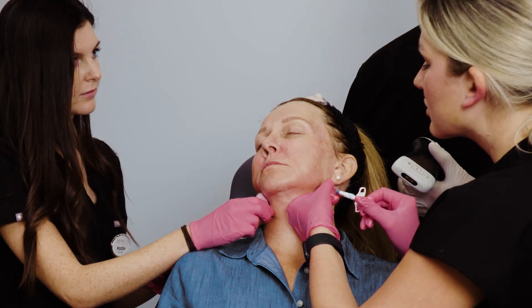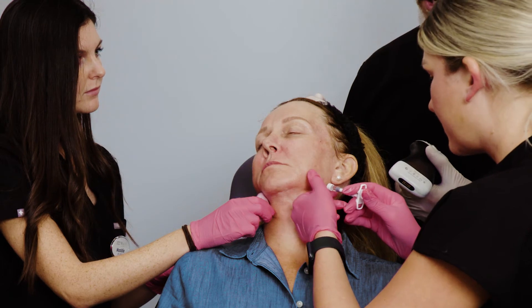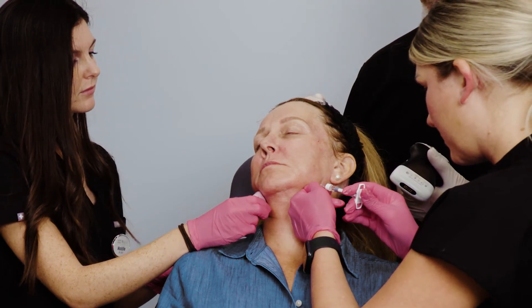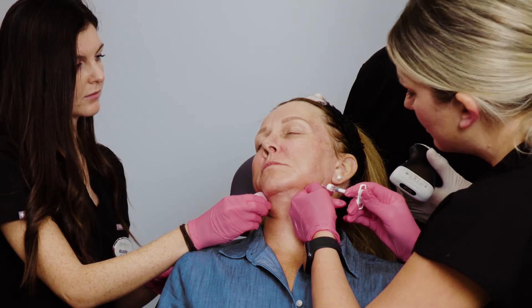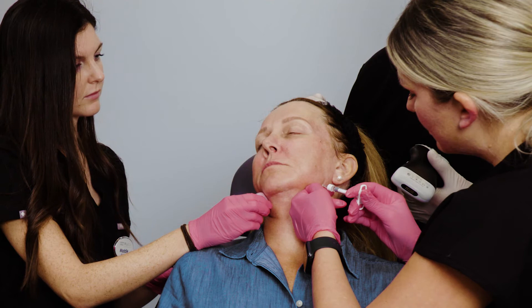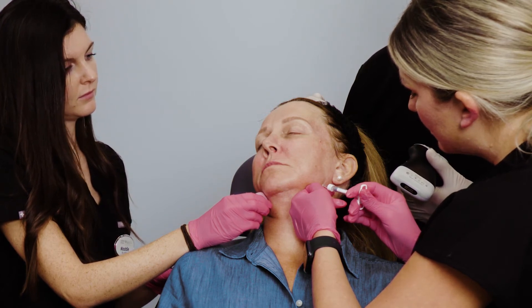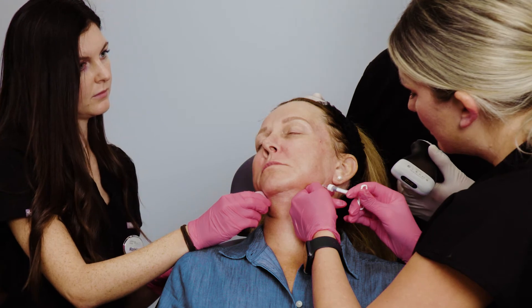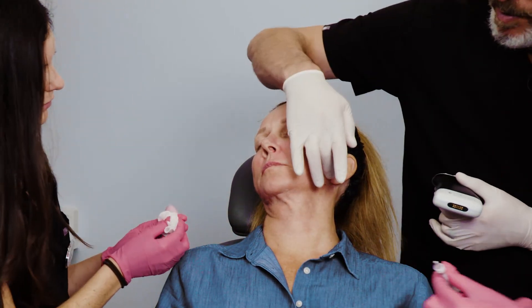She's aspirating right now for 10 seconds - no reflux. And she's going to inject down to the bone. Perfect job. So we have great improvement there. Now let's check it with ultrasound.